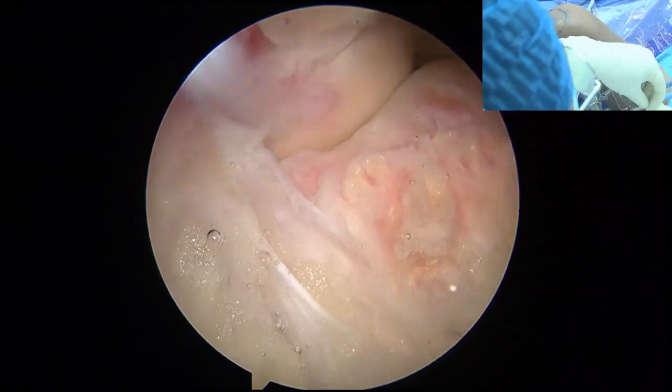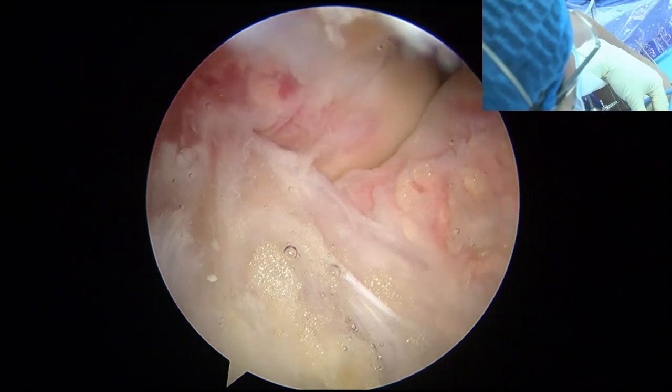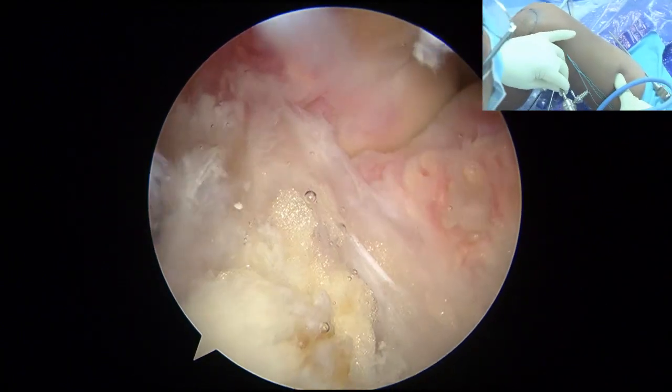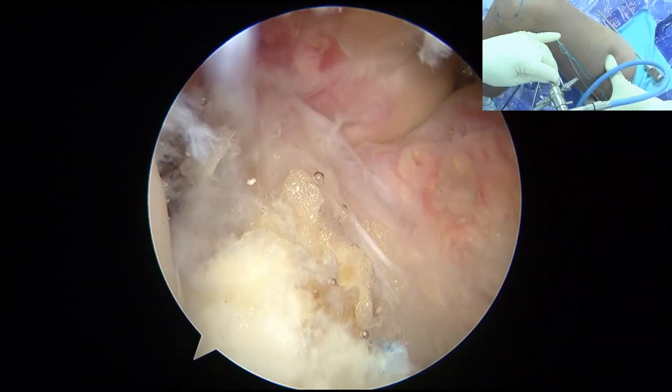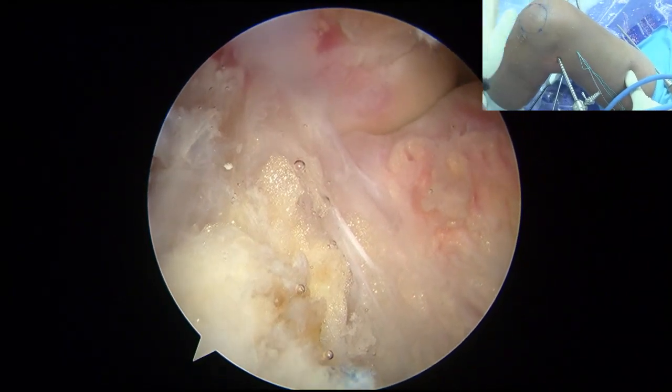So now you got that, right? Yeah, you're looking for the center. This is center. 好,这是中线. Between the medial and lateral femoral condyle. You see the center, right? 就沿着股骨内外科. So you go to the center, okay?